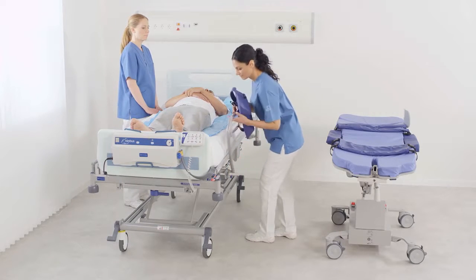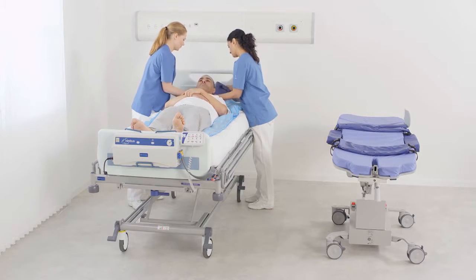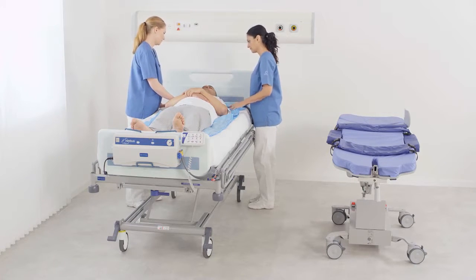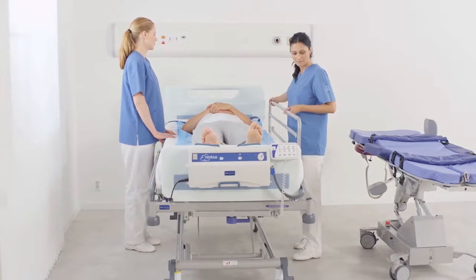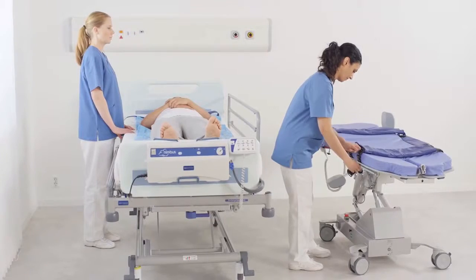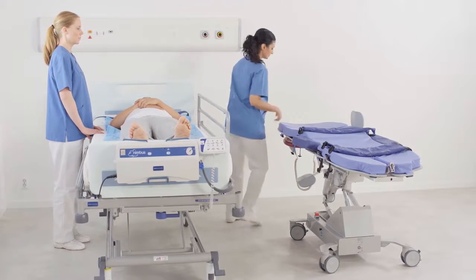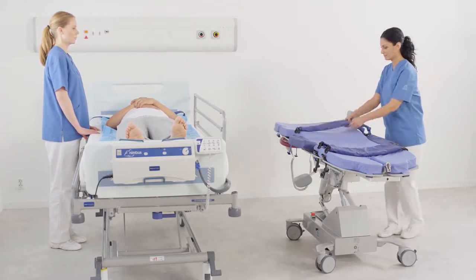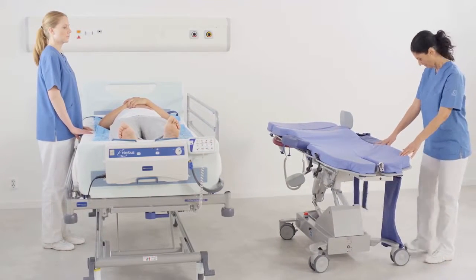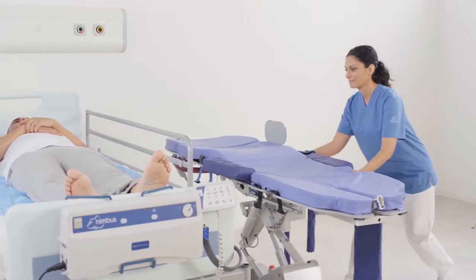Fold down the bed rail on the transfer side of the bed. Place a pillow underneath the patient's head. Fold up the bed rail on the transfer side of the bed. Unbuckle the safety belts. Fold away the straps. Gently tap the brakes to release them and position Sara Combilizer parallel to the bed.